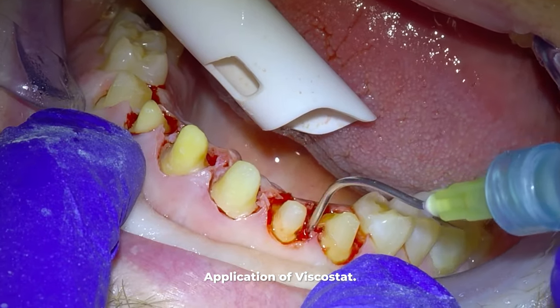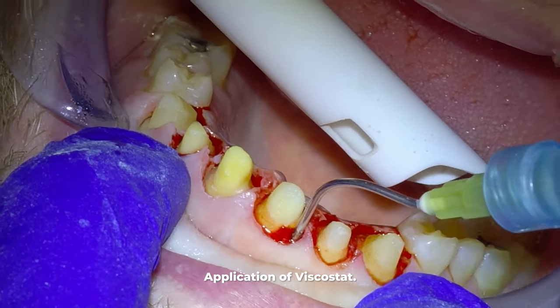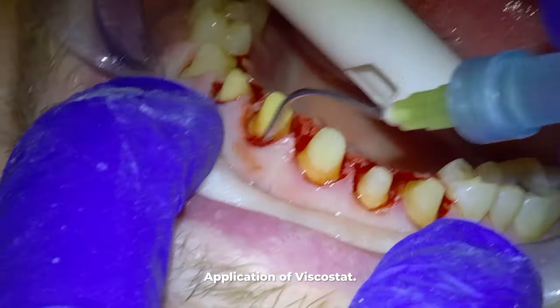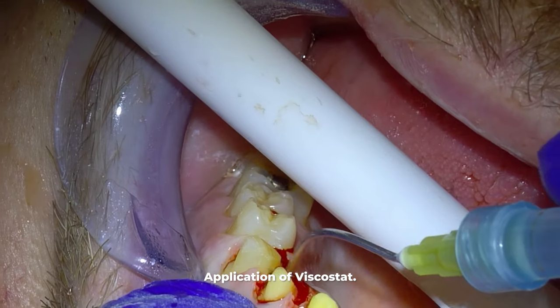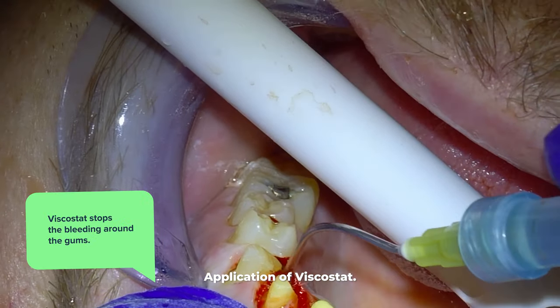To build everything back up, we have to start by taking impressions of these teeth and send them to a lab that will make the final cosmetic crowns. To take accurate impressions, we first have to stop the majority of the bleeding around the gums — that's what this stuff I'm applying now called viscostat does.